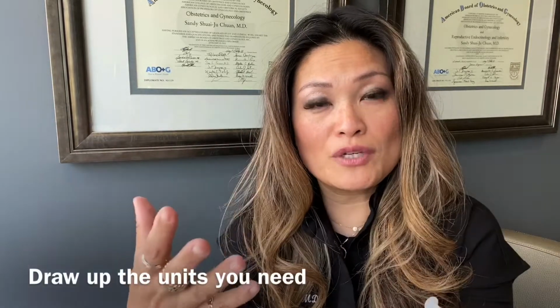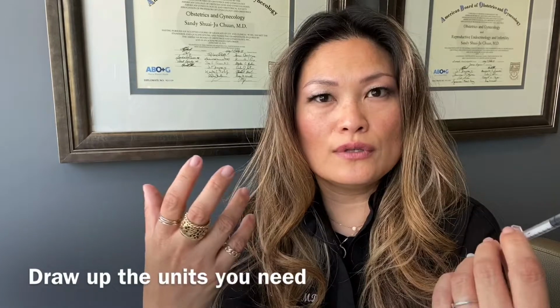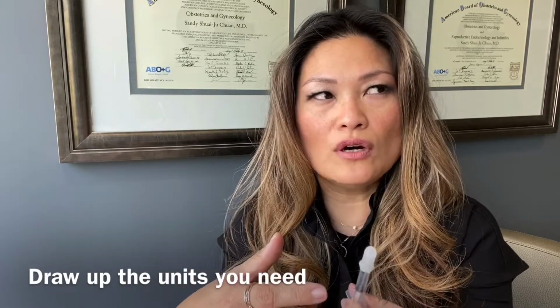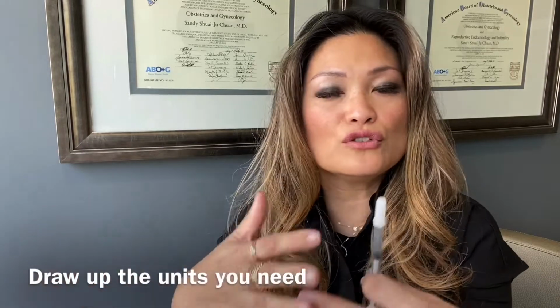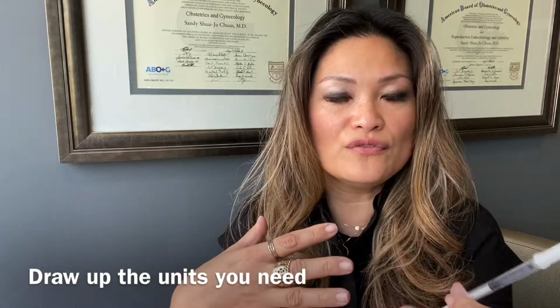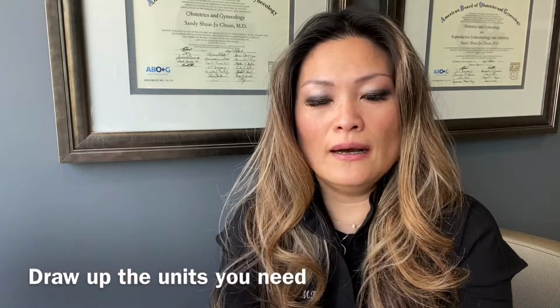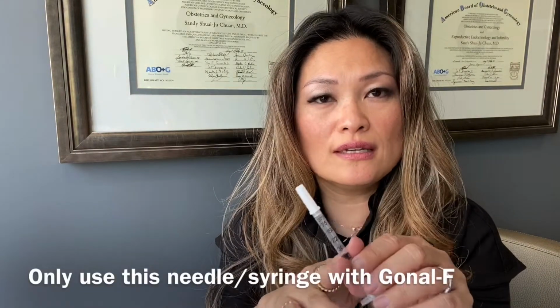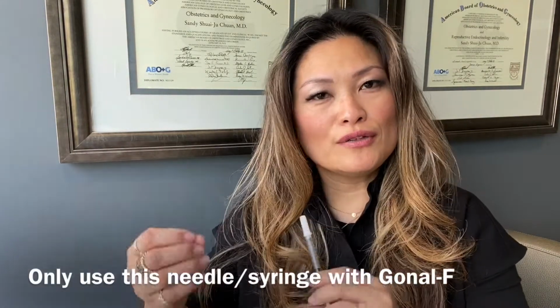So again, look on your protocol or your treatment calendar, and it's going to tell you how much Gonal-F you need. It may be 75, it could be all the way up to 375, so it just depends on your protocol. A pretty common dose is somewhere between 150 to 300 when you're doing an IVF cycle, but that's what the marking is. You do not want to use this needle to draw up your Menopur.